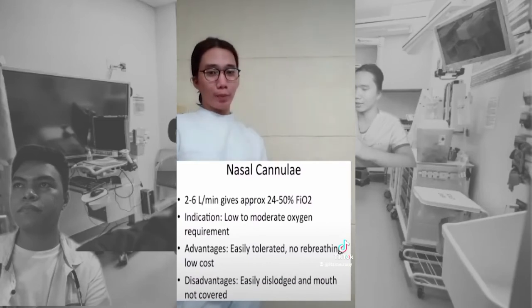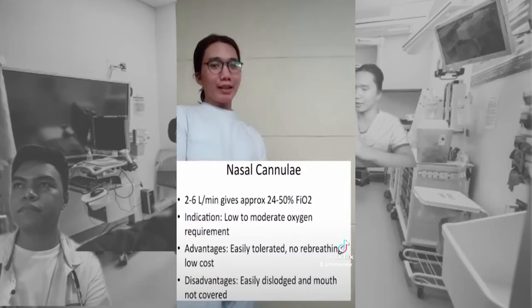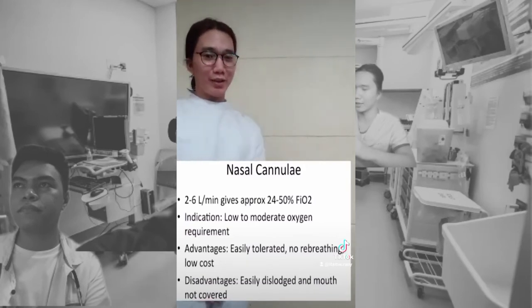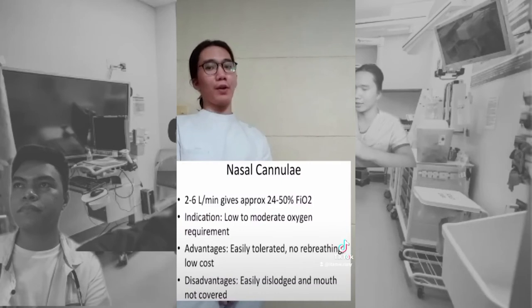It is comfortable, it is easily tolerated, the patient can eat and speak easily, and the patient is not rebreathing their own exhaled air, and most of all, it is cheap. However, the nasal cannula can be easily dislodged, and the effectiveness depends on the patient's breathing, since the patient can still breathe through their mouth, which alters their FiO2.